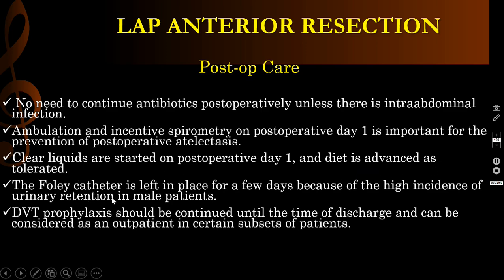The Foley catheter is left in place for a few days because of the high incidence of urinary retention, especially in male patients. DVT prophylaxis should be continued until the time of discharge and can be considered as an outpatient in certain subsets of patients.